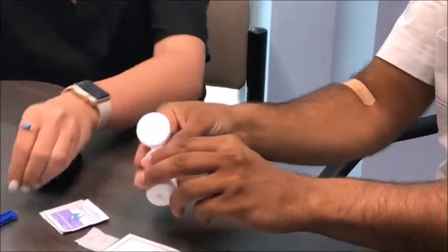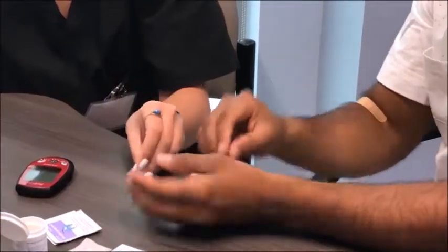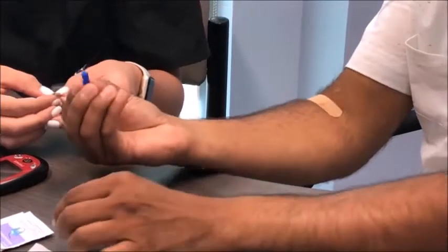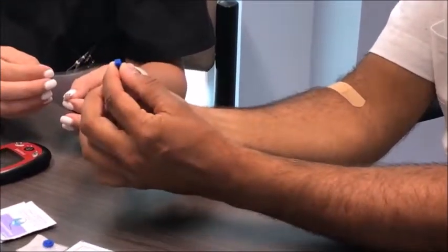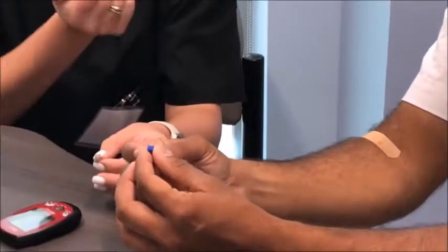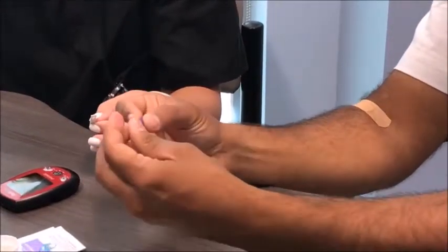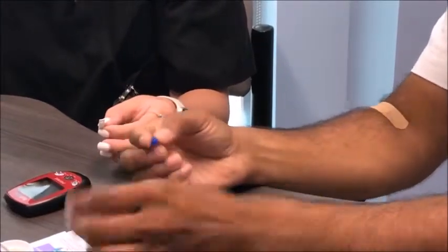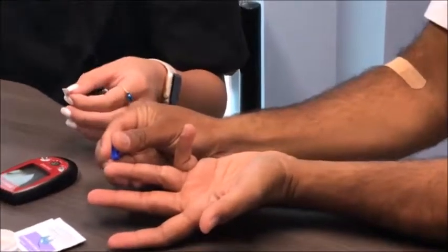All right, I have this ready. So unscrew it just like that. Perfect. And this would stick into the lancet. Exactly. If you use the pin, the pin would sort of do the sticking for you. You should unscrew it first before sticking it in, because otherwise you could stick yourself.